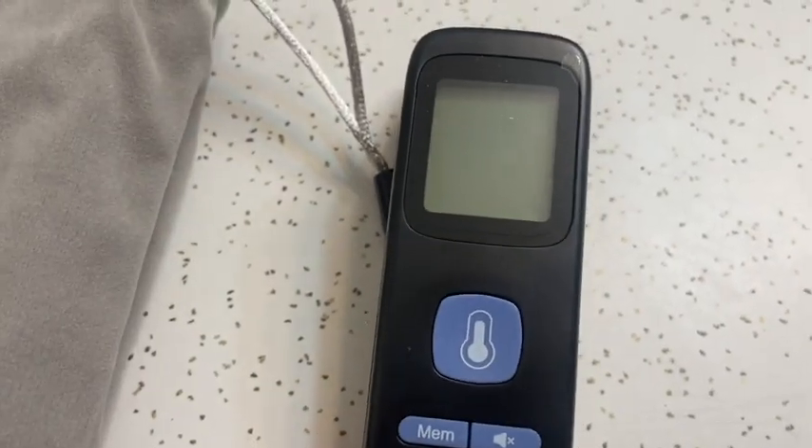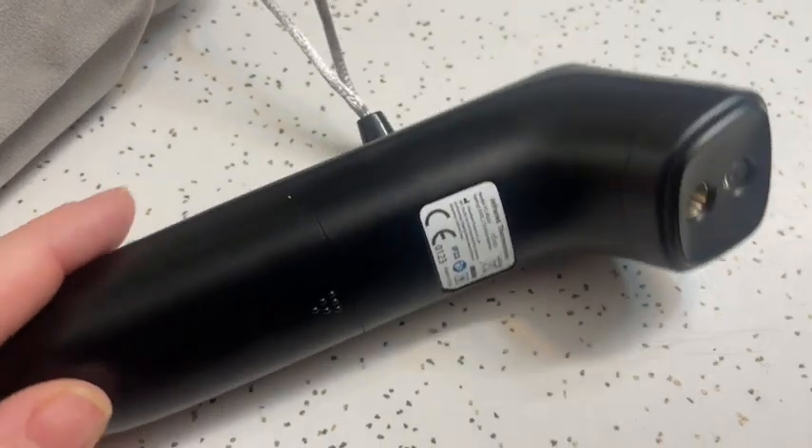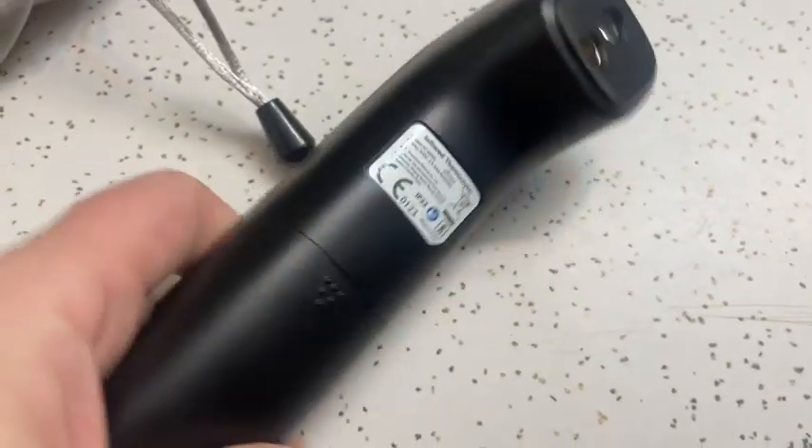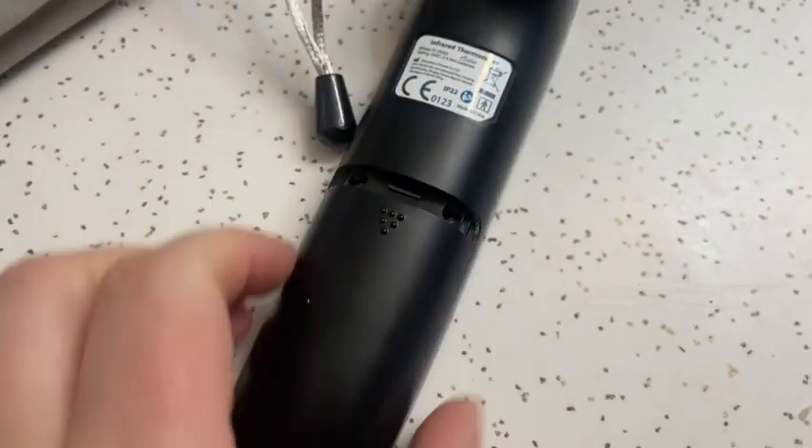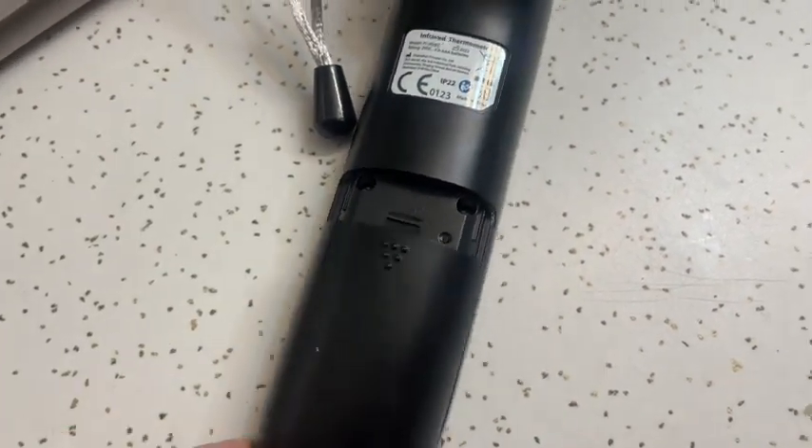Hey guys, it's Sam here with WTI. As we're approaching cold and flu season, RSV season, cold season, all seasons — you probably need a thermometer in your life, and I recommend this one. I had mixed opinions about forehead thermometers because I felt like they weren't very accurate, but comparing this to other thermometers, it is fairly accurate and I definitely approve.